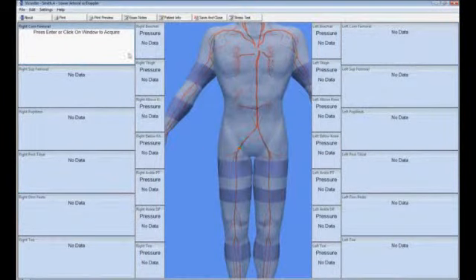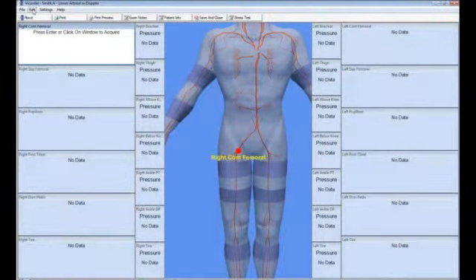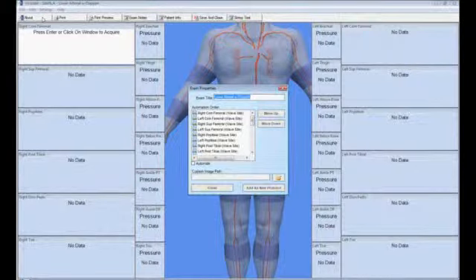Custom protocols can be derived from standard protocols by clicking on the Edit button at the top left-hand corner of the screen. An option to edit the exam will appear in the drop-down menu. A dialog will open enabling you to customize the exam. You can move sites up and down or automate the protocol by checking the box. A custom image may be selected by specifying its path.